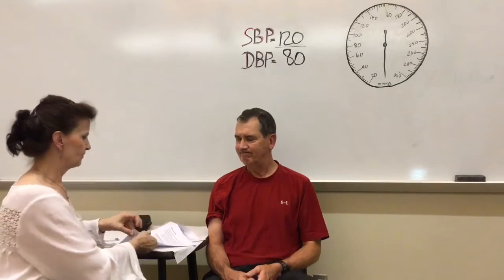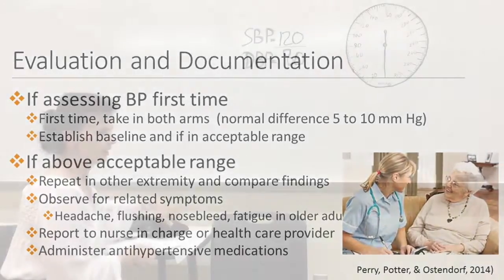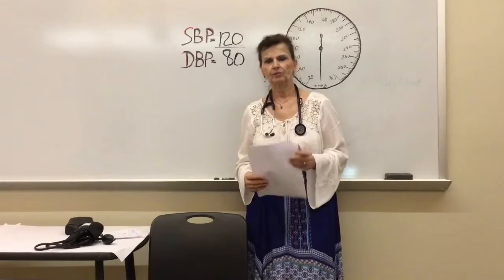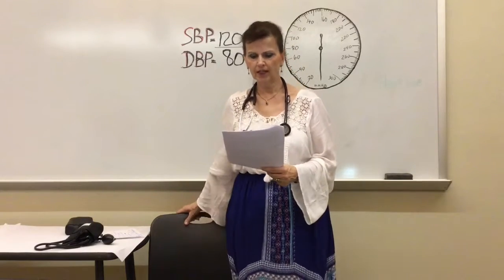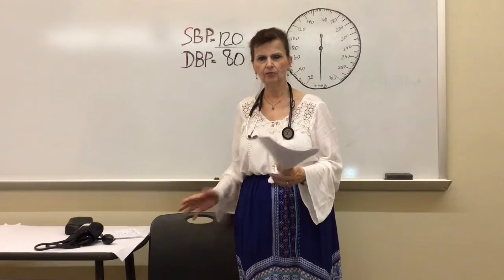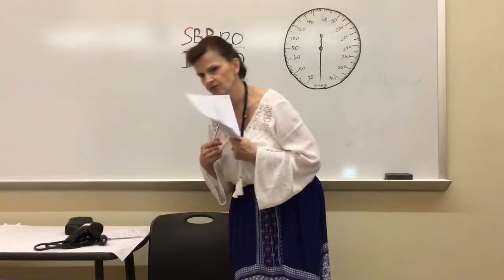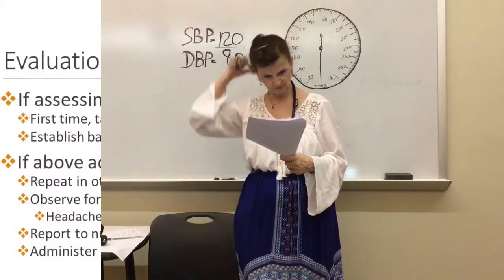Okay, thank you. Make the patient comfortable. Okay, so by telling the patient their blood pressure, it promotes participation in care and understanding of the health status. Also, it makes the patient accountable for follow-up assessments. At this point, we will perform our hand hygiene, clean the earpieces with an alcohol wipe and the diaphragm.